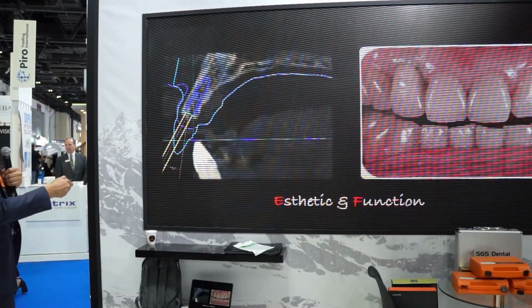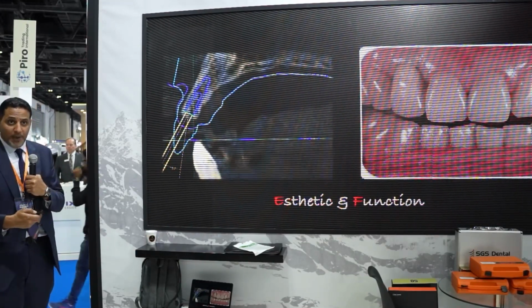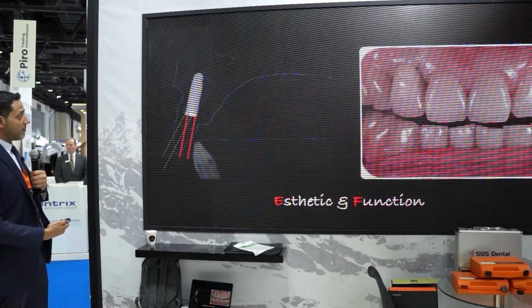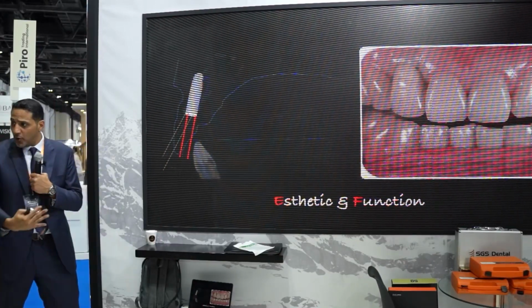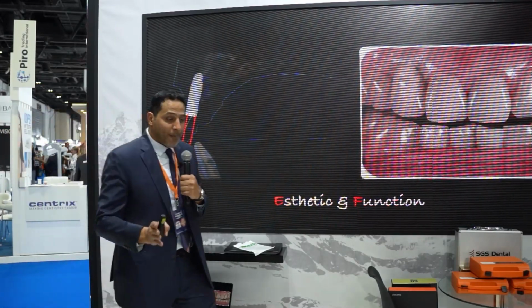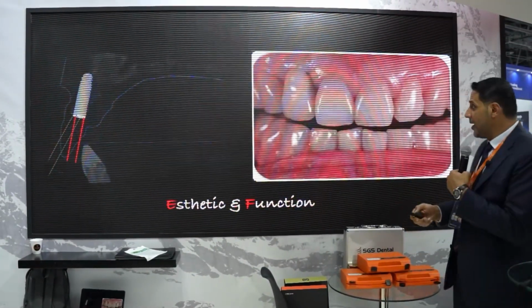This is an illustration of where the implant was placed, and this is the angulation. If it is prosthetically driven, it is supposed to be in this direction. So it needs from me adjunctive steps, which are bone graft or guided bone regeneration. The surgeon took the easy way, which placed the implant bone driven, not prosthetically driven.